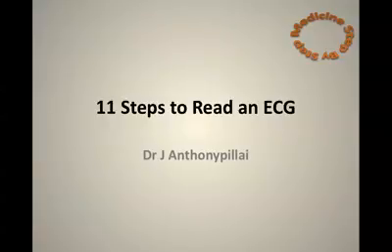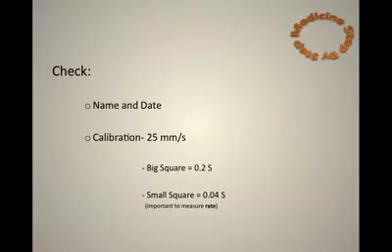Hello everyone. Today I'm going to go through the 11 steps to analyze an ECG. First, a few basic principles you should apply to anything that you assess.